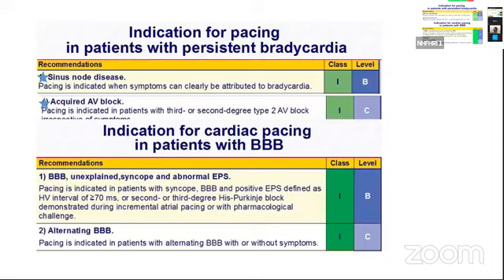Yes, we can hear you. Please stop the share. We can hear Shamim. We can hear you clearly. Why don't you go on saying whatever you prepared? Current vertigo, dizziness, and blackout. So we did the angiogram, as the patient is aged and a long-time diabetic. We did the angiogram just today. Angiogram was normal, non-critical, with mild dilation in the LAD.